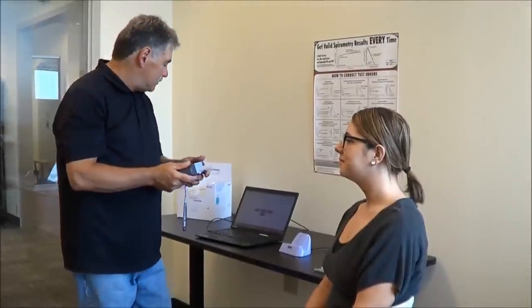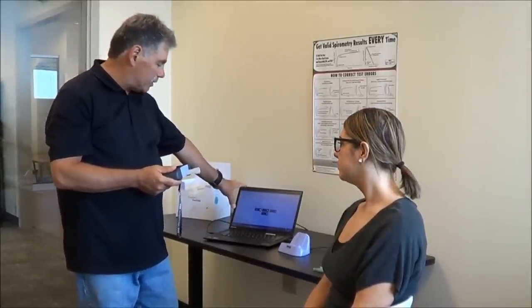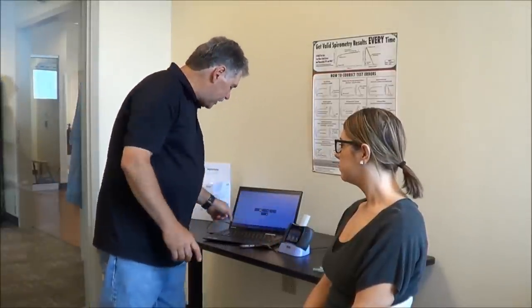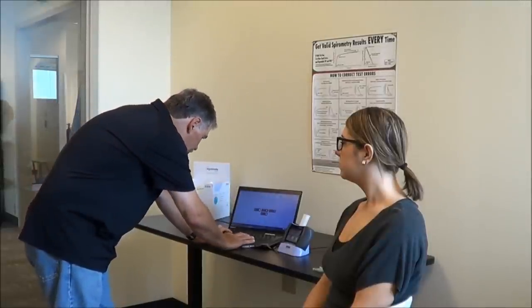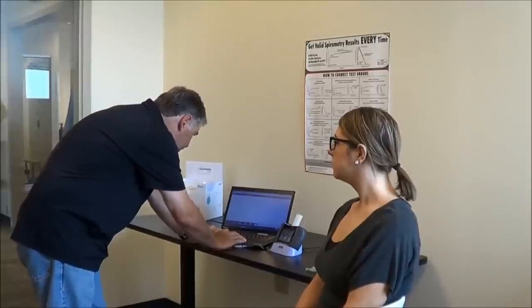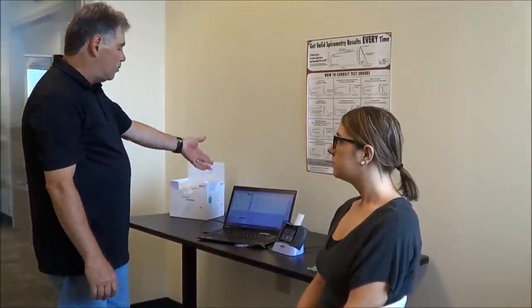The other option is if you're using the EasyOne Air with the EasyOne Connect PC software, that software will be loaded on a computer, and instead of printing direct, I can dock it in the cradle while it's connected by a USB cradle to the device. The test will download into the software, and from there I can pull up the test and see that the data is downloaded, and from here I can view, print, trend, make a PDF, do all sorts of things that the power of the computer will give me.